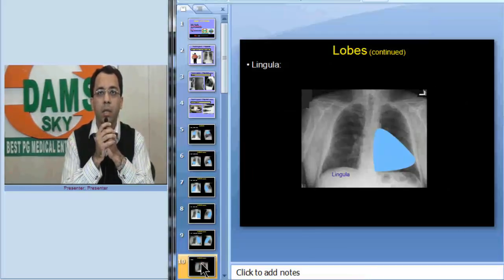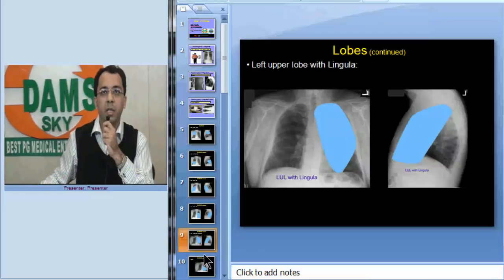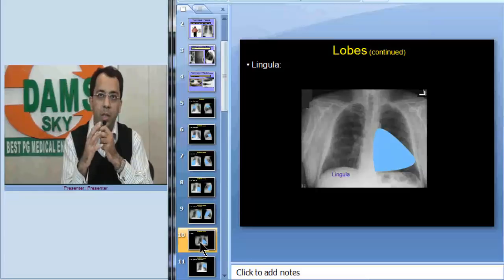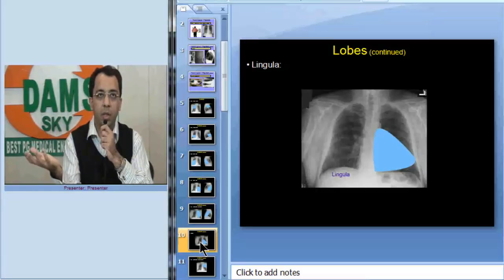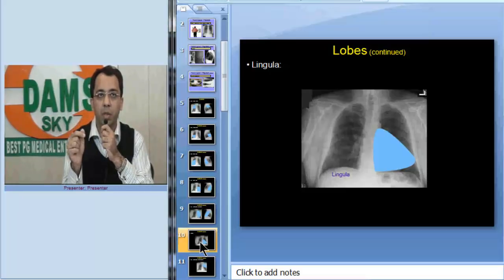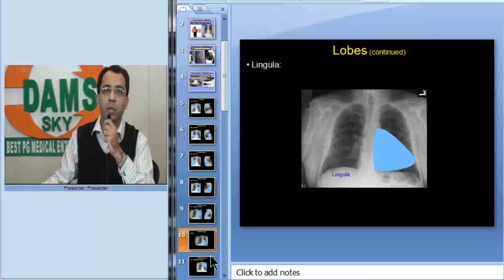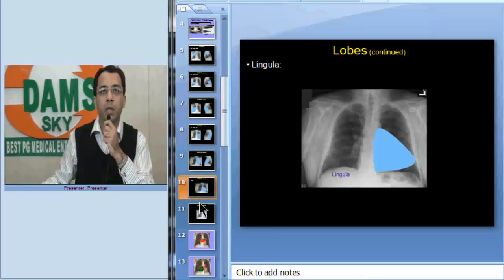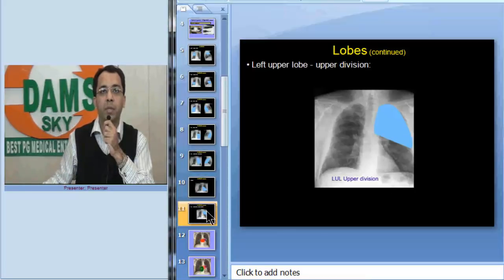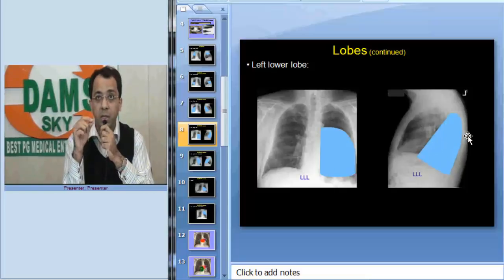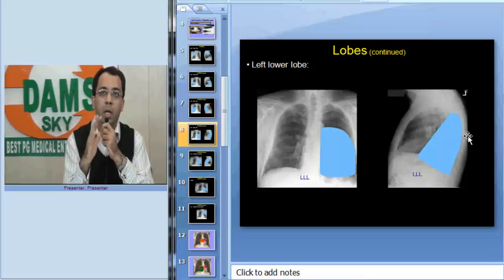Now let us look at the lingula. The lingular segment is anatomically on the left side, similar to the middle lobe on the right. So lingular pathologies will obscure the left cardiac border. The upper division of the left upper lobe and the lingula are distinct segments, and the left lower lobe is a posterior structure.